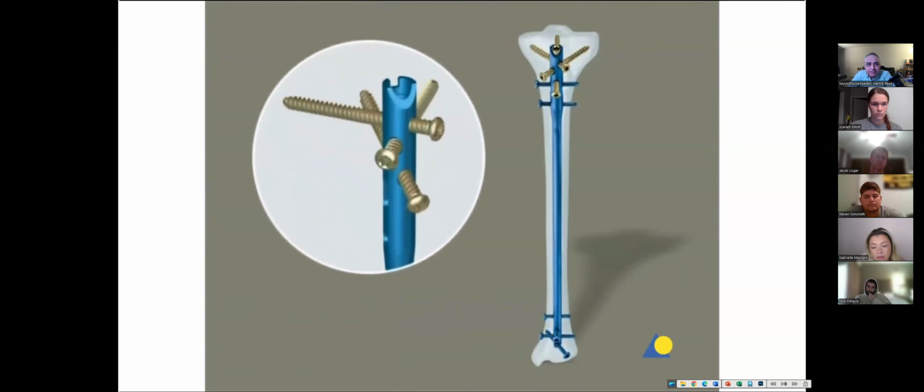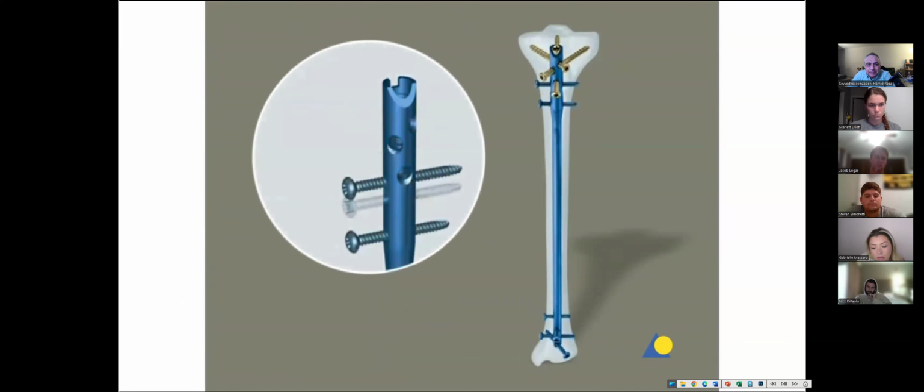There are several possibilities for proximal locking. 3 of these locking options use cancellous bone locking screws to improve stabilization of the proximal fragment. The 2 mediolateral locking options enable primary compression or secondary controlled dynamization.